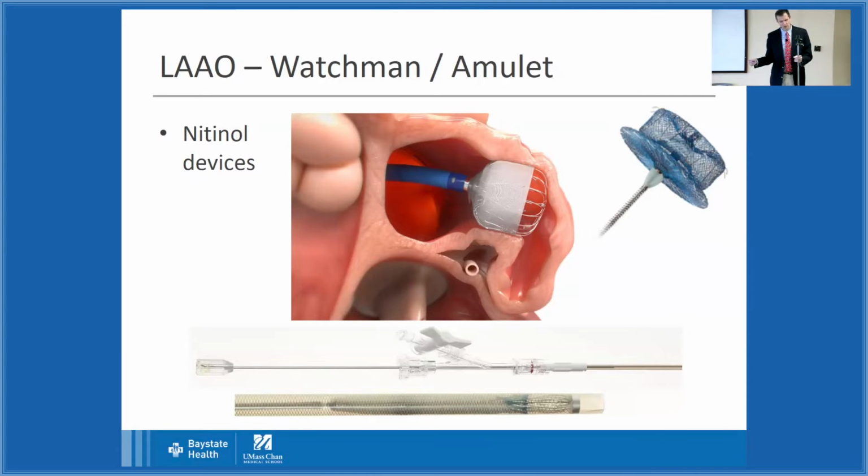They priced it out, actually. Each amphibious assault ship they built out of nitinol would have been about $80 trillion, and they estimated they needed about 2,000 of them. So they didn't end up pursuing that plan a lot further, but you can make nitinol medical devices for about $50 each. And that's the concept and the technology.